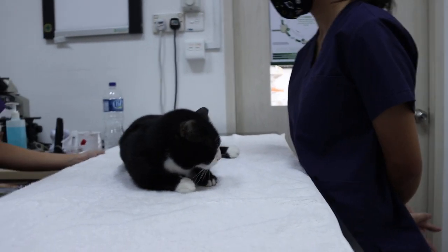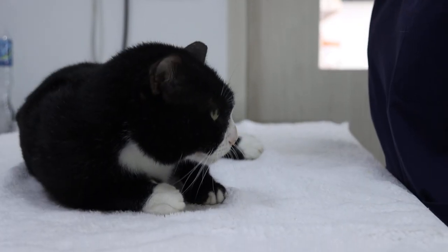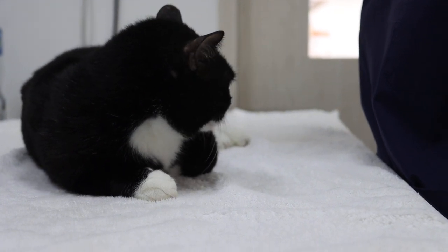Today is the 16th of January 2021. This is a demonstration on how to draw blood from a golden retriever for blood tests. We do not have a golden retriever so we will demonstrate using a cat.